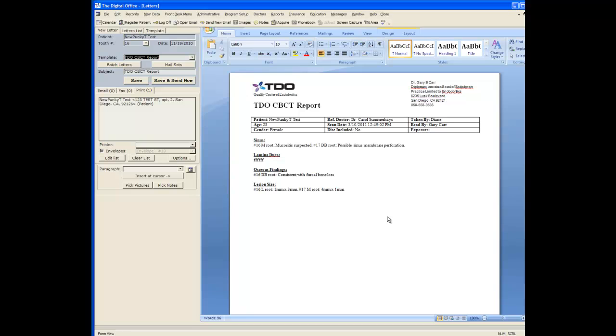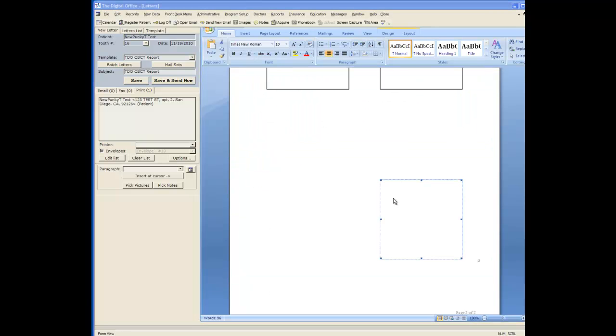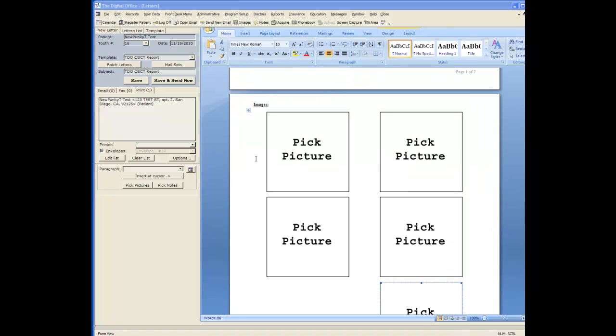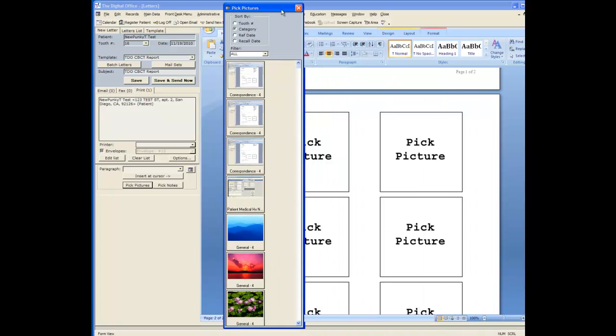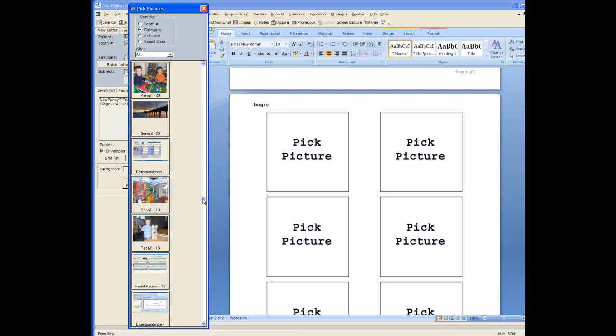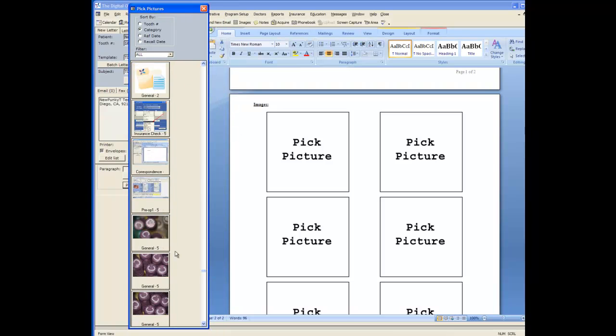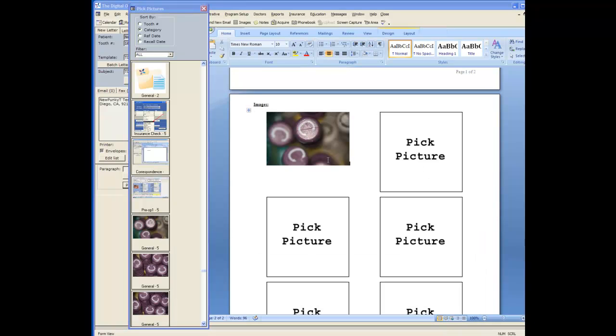On the second page of this report is a place for images. And to put these images on the easiest way is to click your pick pictures box. Your images will show up in this format. Scroll through to find the one that you're looking for and paste it into the box by clicking the box and then clicking the image.